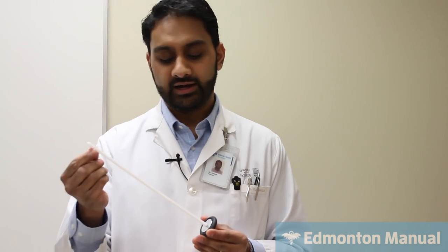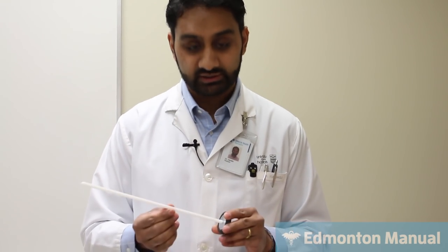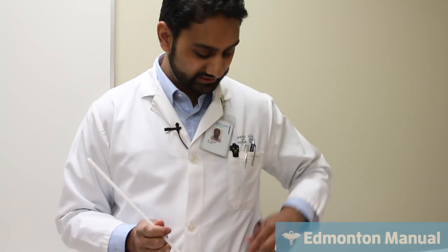I've seen people string it through the buttonholes on their lab coat, and that's okay. I don't know if it's a fashion statement, but it is a way to carry it. You can buy some of these that actually have a retractable handle, and that makes sense. I actually did own one of those at one point, but it broke. And so I decided, well, this one really isn't going to break. And as long as you practice, it works just fine.